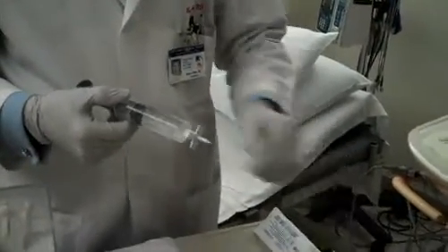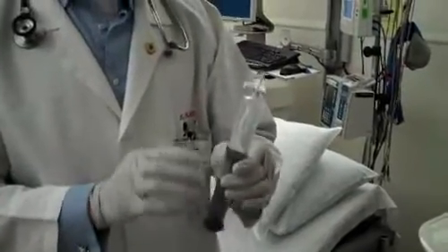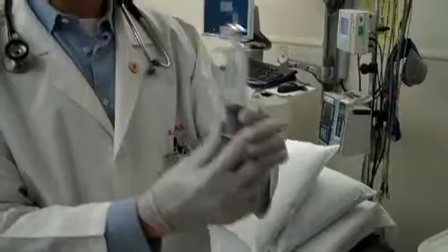If you're using OptiSan, OptiSan has about 3 mls in the vial, so I would draw out 27 mls rather than 28.5.